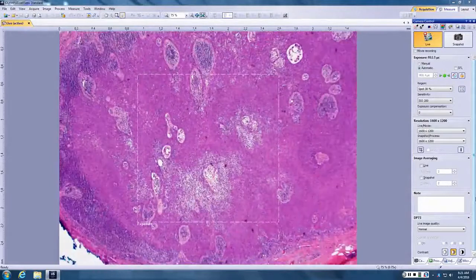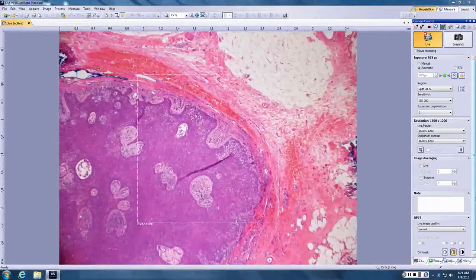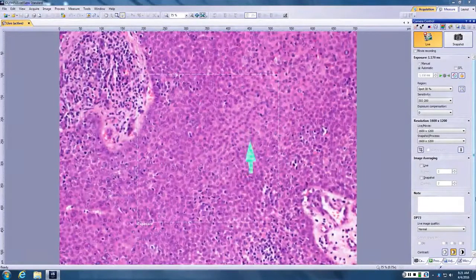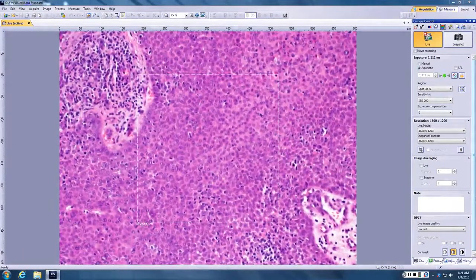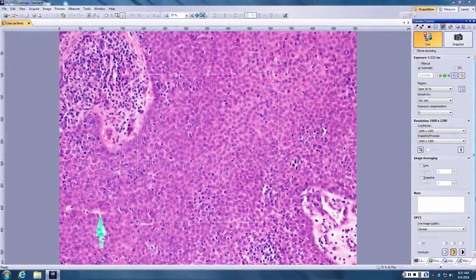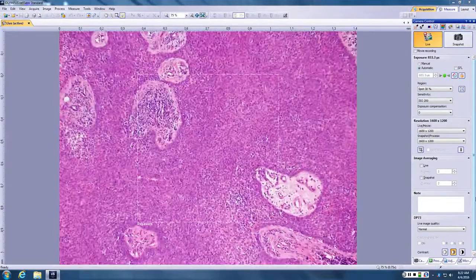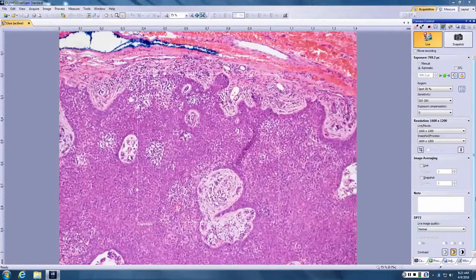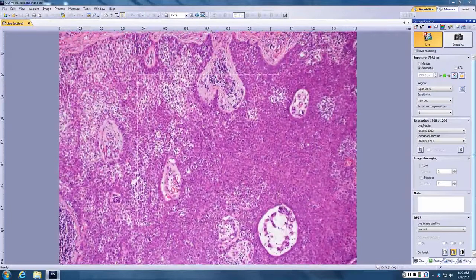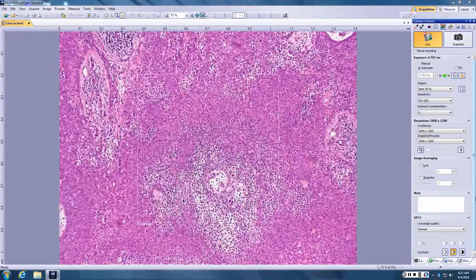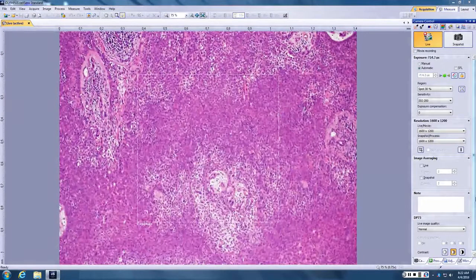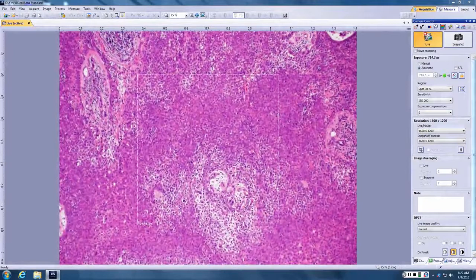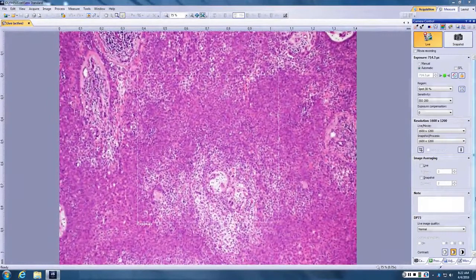Sort of like a deep dark nodule in the reticular dermis. So deep dark nodule. And is it just nuclei or does it also have pink cytoplasm around the nuclei? There is some cytoplasm in the nucleus. And then does it have tiny little round lumens in it? I can ask if you really squint a little bit. So with a little squinting, a few little round lumens. So what kind of cutaneous tumor would not palisade, would be well circumscribed, would have clear cell change, polygonal cells with cytoplasm, and focal round ducts? I'm sorry, you may have said it. Anyone want to jump in? Yeah, hidroporoma group of tumor, very good.